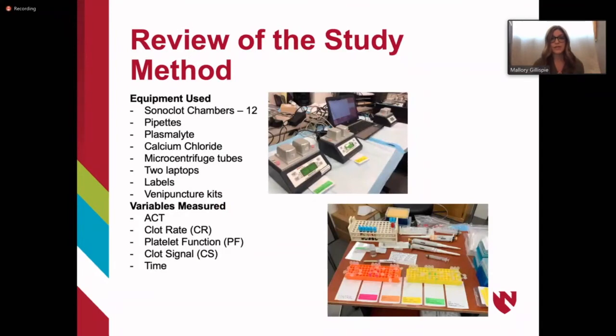So here's a review of the study method we used. Sienco was super generous with us and allowed us to borrow 12 Sonoclot chambers. And we were also really fortunate to be able to use our school's simulation suite to do all of our data collection, as well as even our subjects' whole blood collection process. We also measured the variables of ACT, clot rate, platelet function, clot signal, as well as time. And all those parameters are displayed really nicely on the actual Sonoclot chamber itself, as well as it connects nicely over to their signature viewer software.